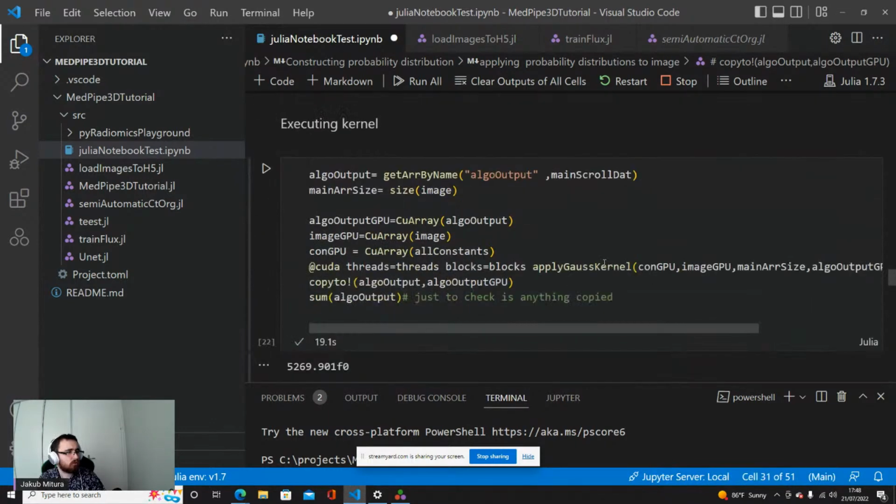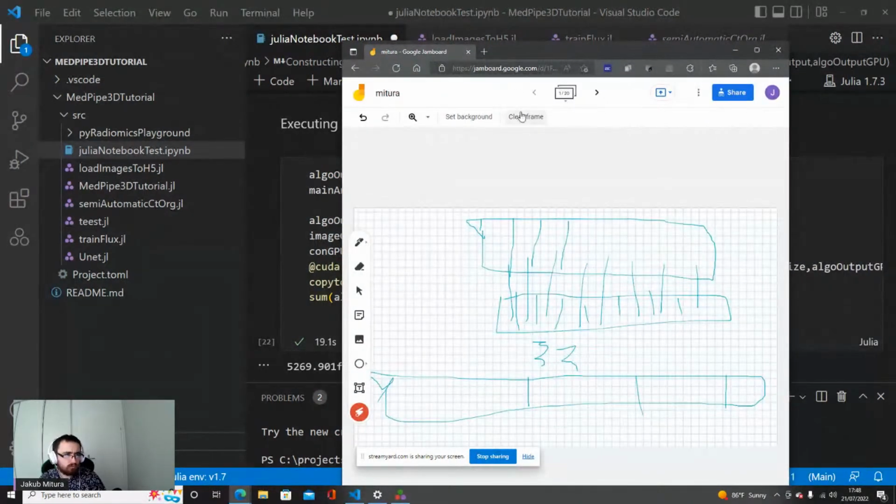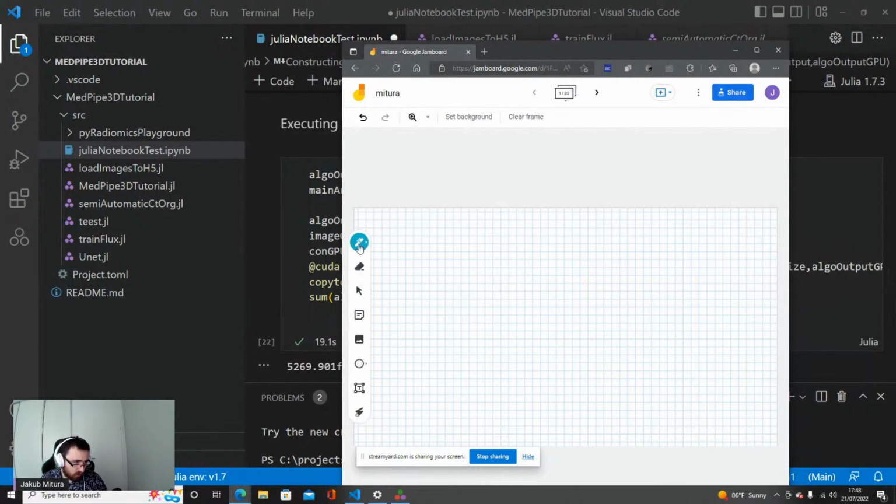Reduce operation, where we are. Basically, in MetricsX, I am using a three-stage reduction. Okay, this is also an important topic, so I will get to this. In case of the GPU, when we are looking at the GPU, we have those thousands and thousands of threads. There are two things that are problematic that we usually do not think about when we are programming on the CPU. The first thing is data moving. This is usually a very big deal.